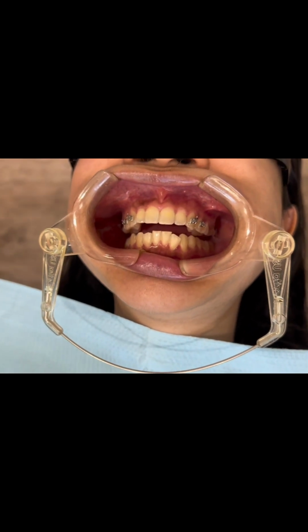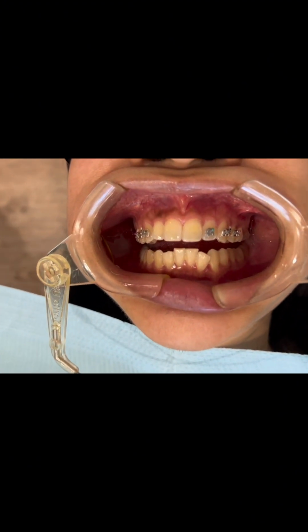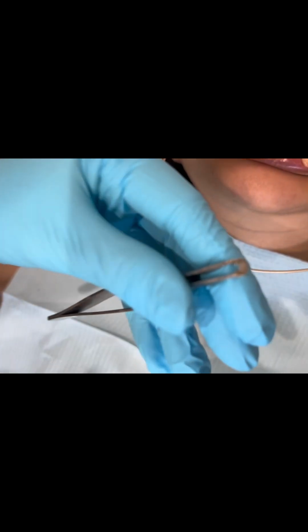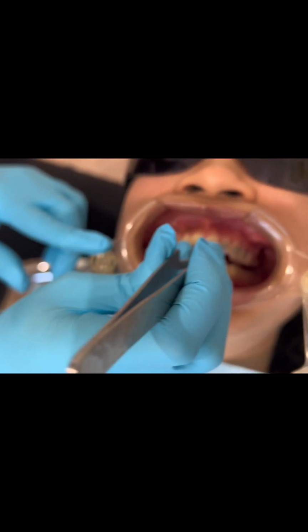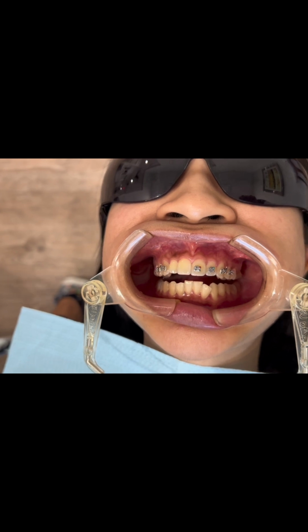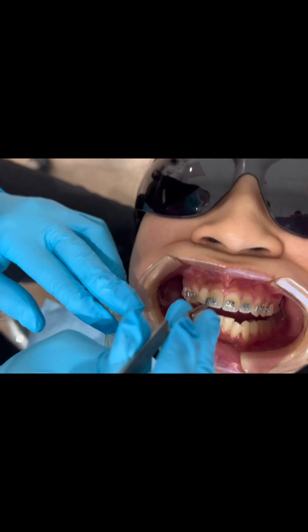All right. You see that? Just like that, a pea size right here. You see that pea size? Flattening it out. And I put it right here, just a pea size. Don't need too much. The more glue you put on, the more glue you're gonna have to clean up later. All right, so just remember that.